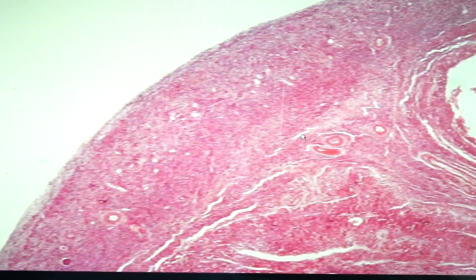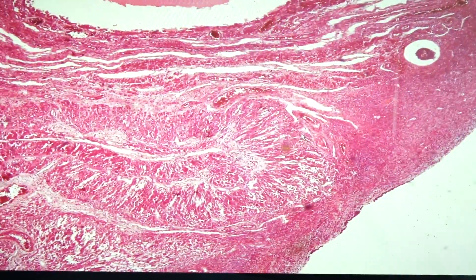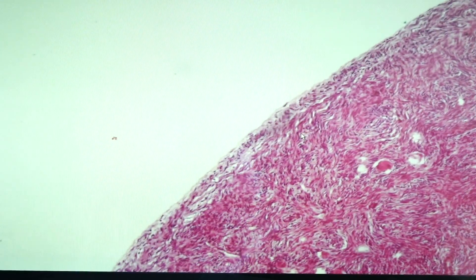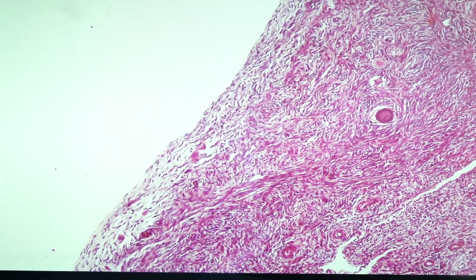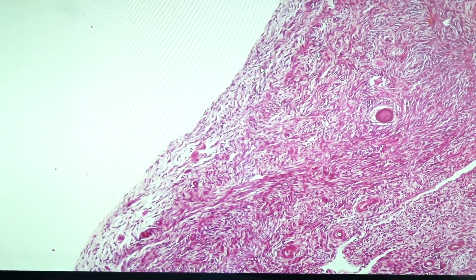The first slide that we have would be the ovary. The ovary would be paired and its outermost covering would be what we call as the germinal epithelium. It is lined by squamous cells — these are the squamous cells, they are flat. Underneath it immediately would be a connective tissue area that we call as the tunica albuginea.